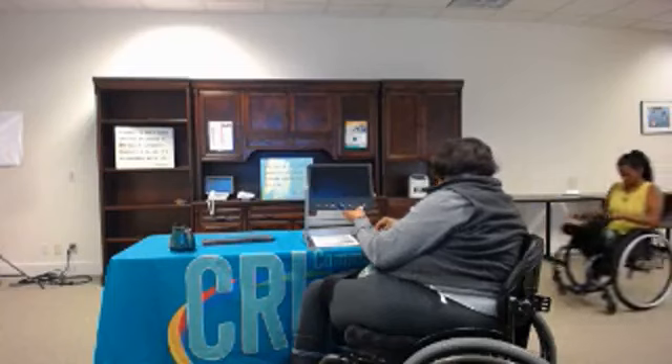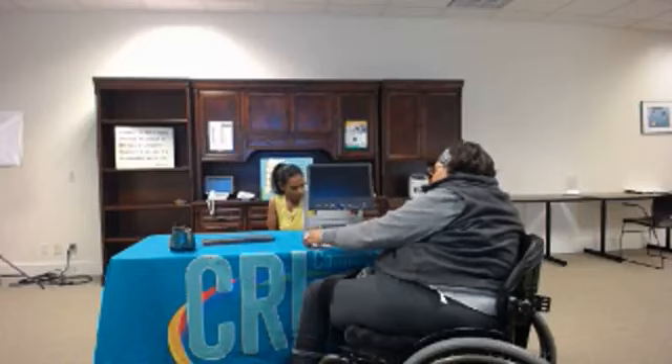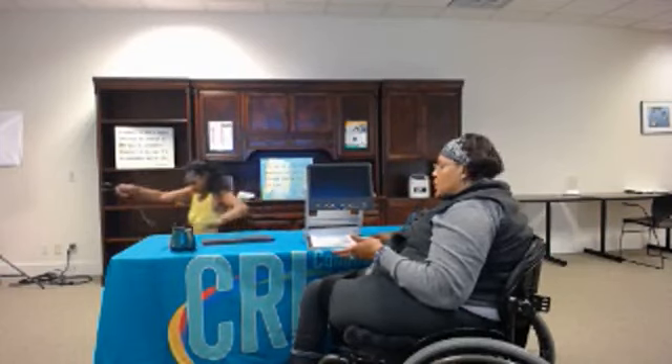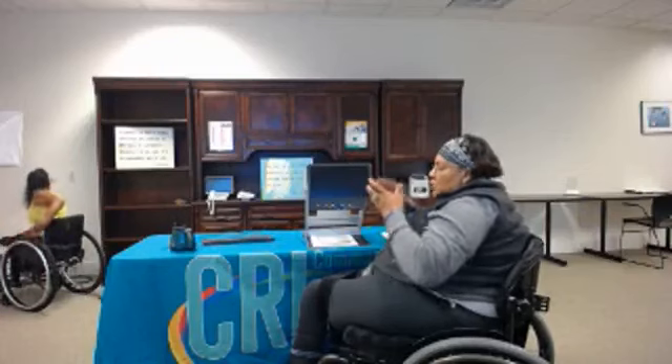Once you get to playing around with it, bring it over to this side a little bit. It's very easy. It's heavy — it's like seven, eight pounds.